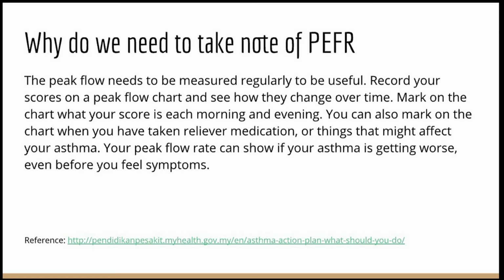I'm here to explain why we need to take note of the peak expiratory flow rate. The peak expiratory flow rate has to be measured regularly in order for it to be useful. We measure the peak expiratory flow rate with the peak flow meter, as shown by my friends in the slide before, and the patient has to record down the score for morning and evening in the peak flow chart, which is on the next slide.